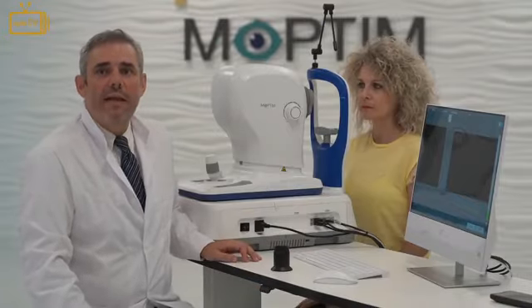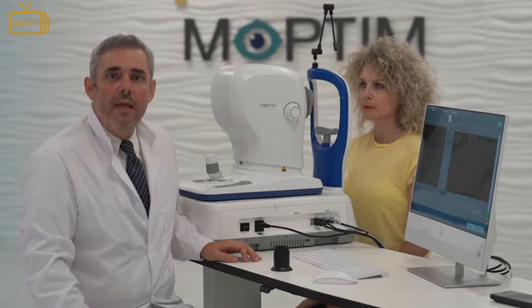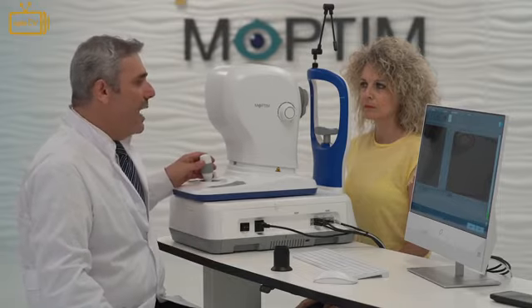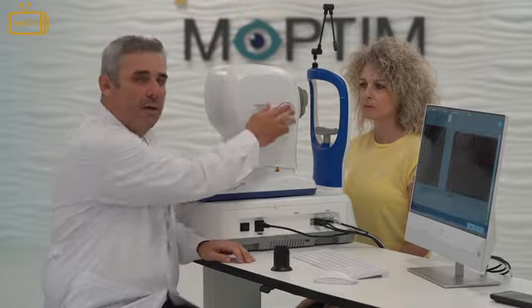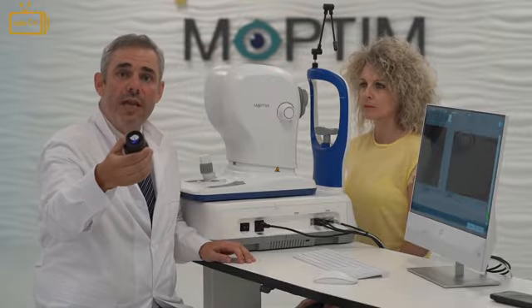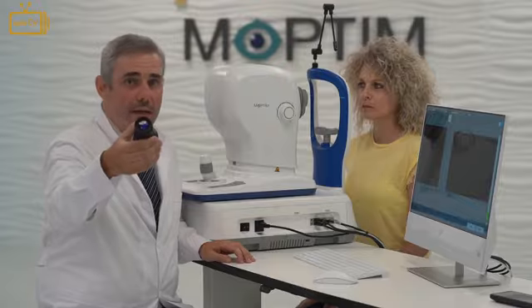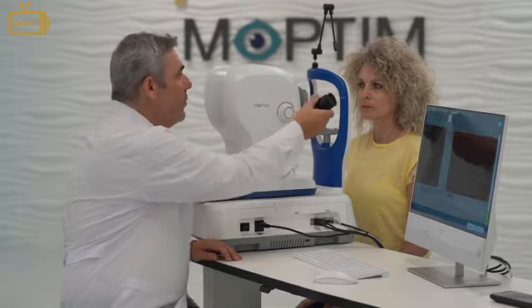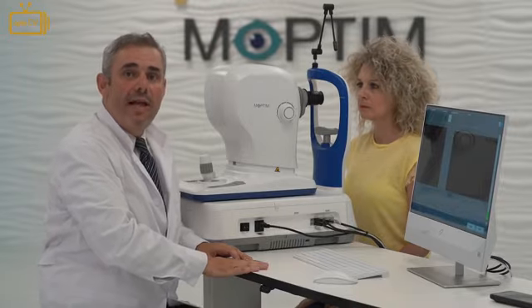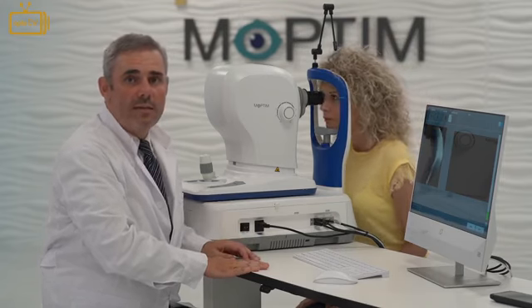Once we have finished with the glaucoma and macula exam, we go on with the anterior segment exams. In order to do this, we first have to pull the OCT head back and adjust the refraction button. We have to attach the anterior segment module, and put it in front of the lens. It is a magnetic anterior module, so it permits us to put it very easily in front. Then we will ask the patient to take the position in order to go on with our scans.